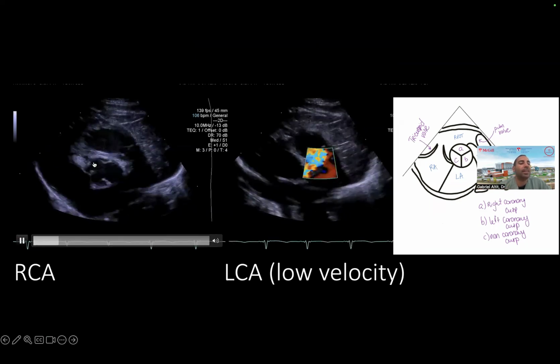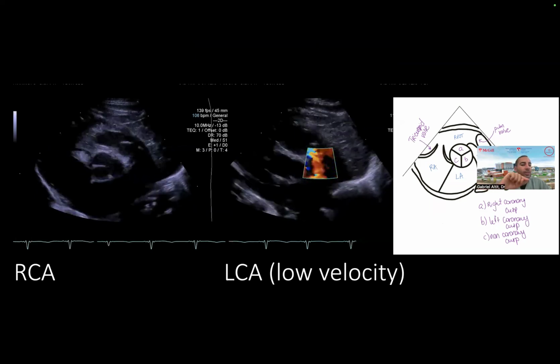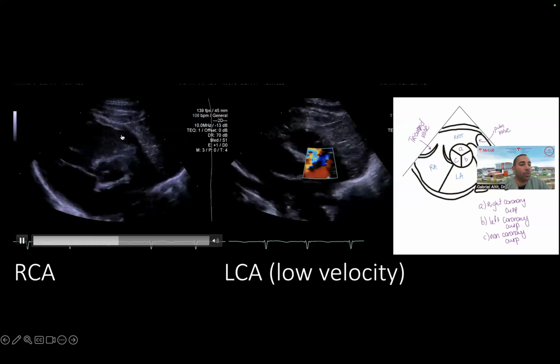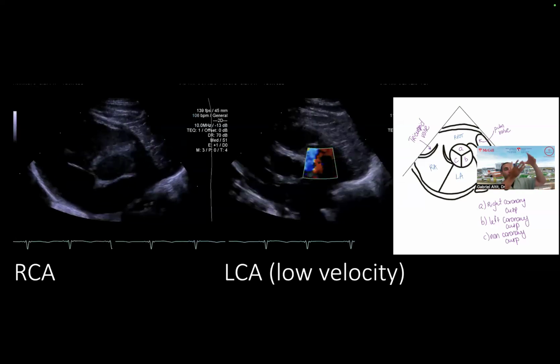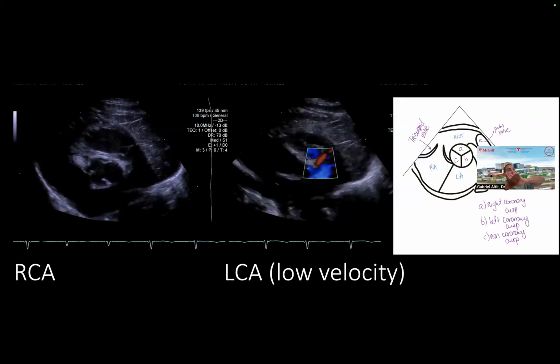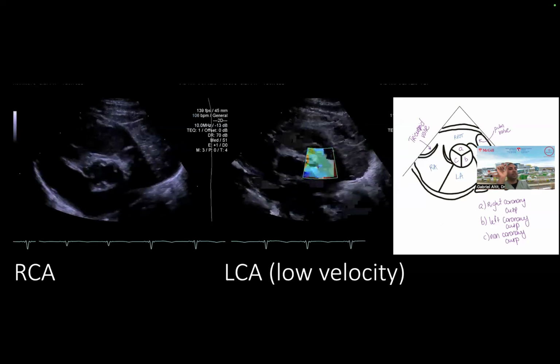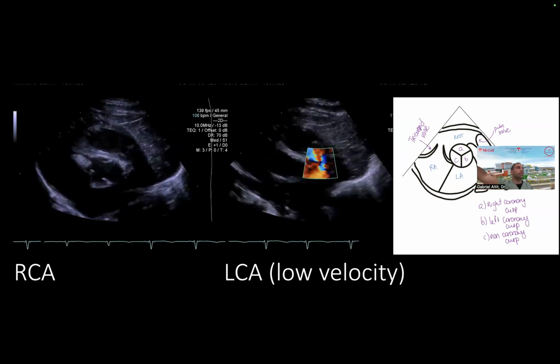You should always have it in 2D because sometimes some of the pericardial folds, because I didn't tell you, but there's area around the pulmonary artery conus that has pericardium. I told you the pulmonary artery is coming out in a conus, like a cone. Around this cone, there's pericardium. And sometimes the fold of this pericardium can look like a vessel. And some people will say, oh, this is the right coronary artery, and just will take a still frame and say, this is my right coronary. And then they're wrong. Actually, there's no right coronary.